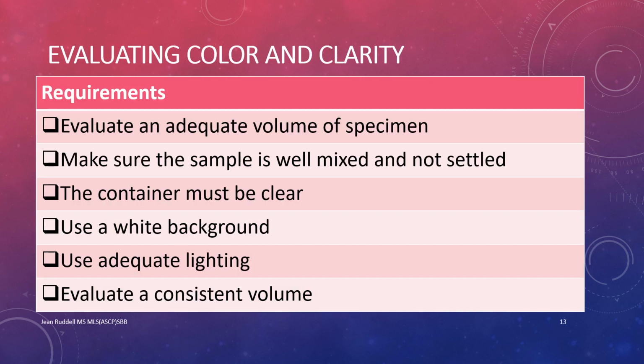When determining the color and clarity, you should have an adequate volume of sample. The sample should be well mixed and not settled. The container must be clear. The background should be white. You should have adequate lighting, and you should use a consistent volume from patient to patient.